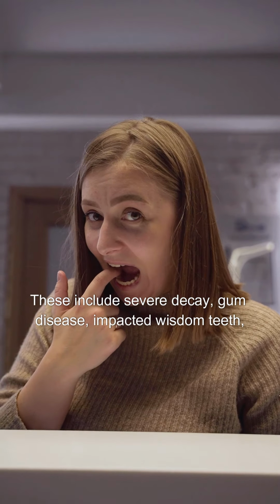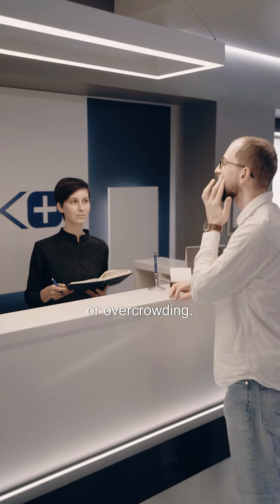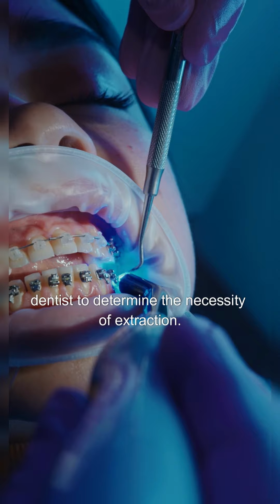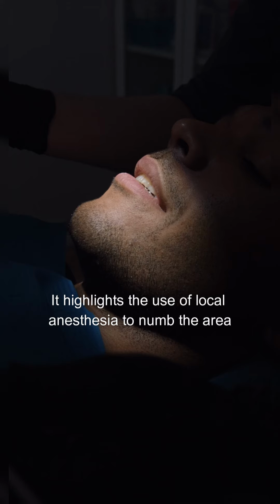These include severe decay, gum disease, impacted wisdom teeth, or overcrowding. It emphasizes the importance of consulting a dentist to determine the necessity of extraction. The video then walks through the step-by-step process of tooth extraction.